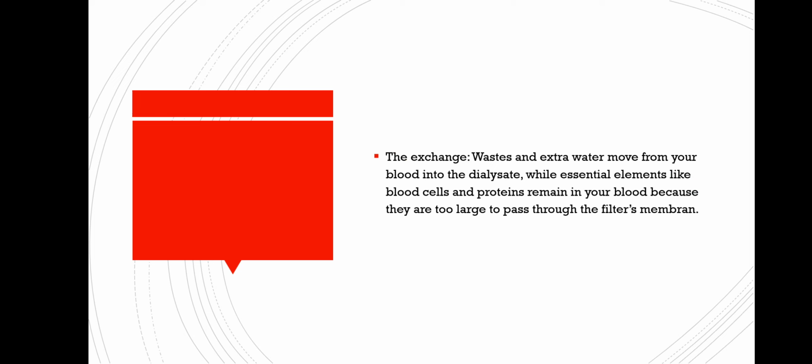The last one is exchange. Exchange is the important factor. Waste and extra water move from your body into the dialysate, while essential elements like blood cells and proteins remain in your blood because they are too large to pass through the filter membrane.